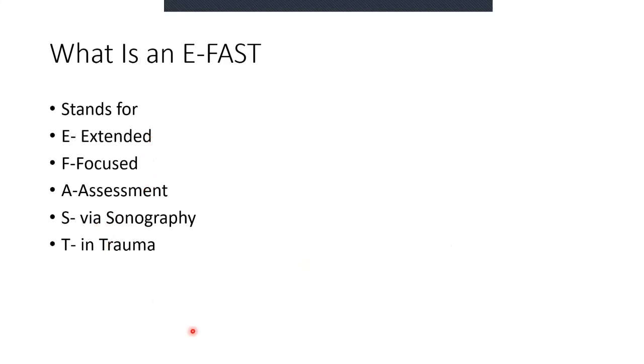All right. So what happened was in 1984, it was decided that ultrasound could be of a lot of use in the determination of a polytrauma patient and how badly they are doing. Very often our polytrauma patients come in with very low BPs. They come in with signs of injuries that we can't necessarily pick up, and by the time we image them, they've deteriorated. So if you can image them immediately, it gives you a good idea of where you need to go first. So that's the historic background.